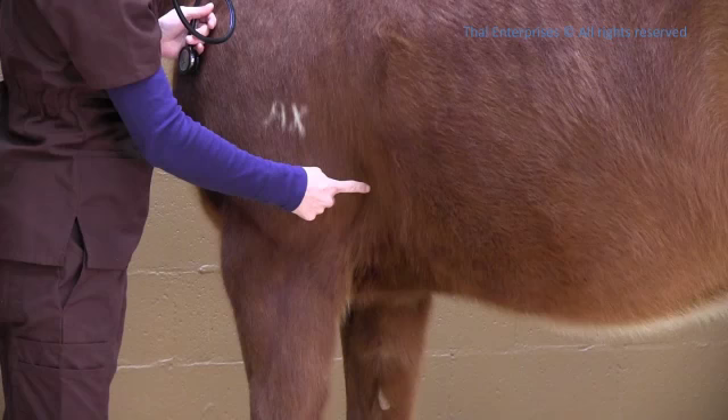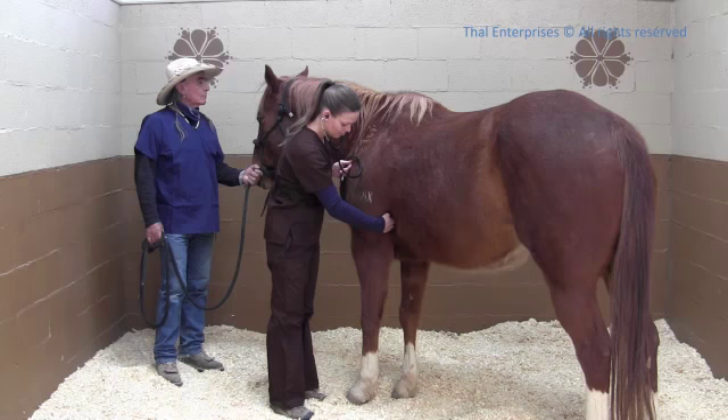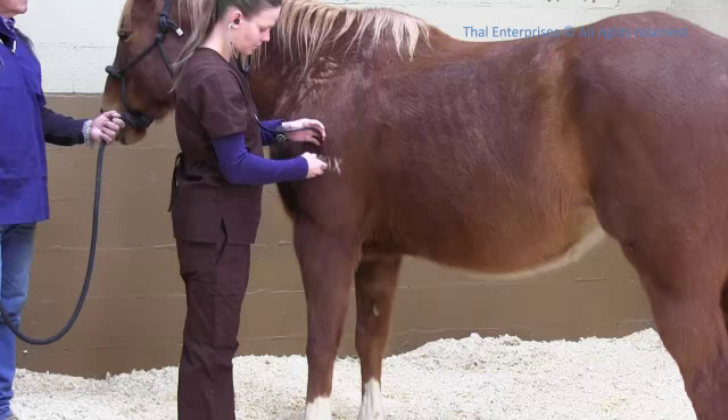Place your stethoscope near the girth location and push it cranial, meaning forward, behind the triceps muscle mass. To make this easier, you can move your horse's left front leg slightly forward.